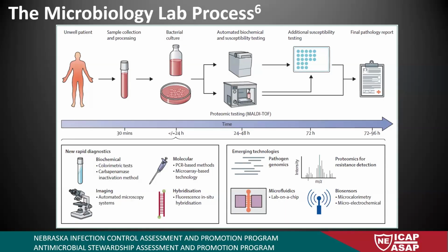It can take a while, up to 96 hours. And if it's something like testing a patient for tuberculosis, it can take weeks. Fungal cultures, if you're looking for something like Candida auris, another fungal infection, can take a week.